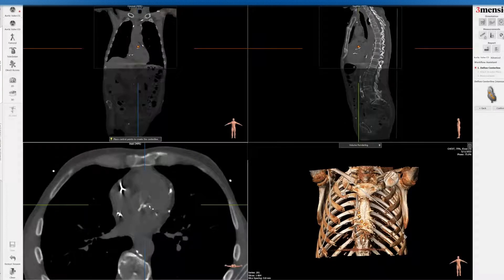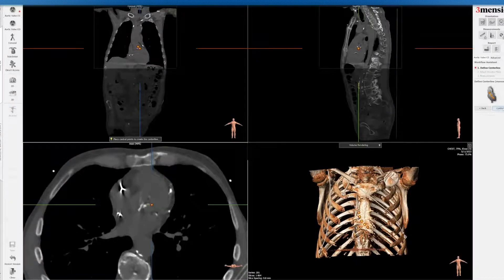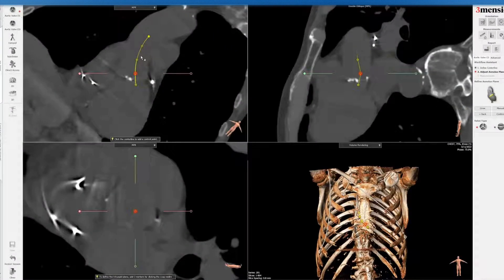You can see the calcific aortic valve, and then you go down to the LVOT. Now there's no contrast here, so it's going to be hard to define the LVOT — so this is more like an estimate. Once this is done, you're going to have to fine-tune the centerline. I'm going to click confirm. And now you can see on this image how this line traces down to the LVOT and across the aortic valve.